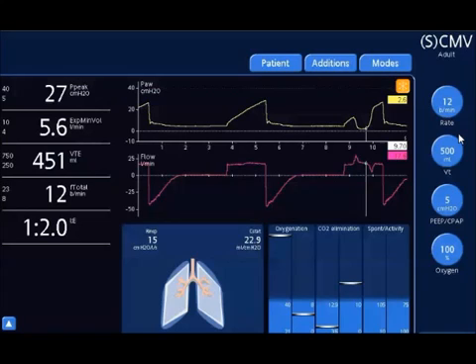And when we are in volume control ventilation, to diagnose asynchrony, my pressure waveform is actually going to be the most diagnostic. So we're going to look at this yellow pressure waveform here on top. And here are my measured values to the left-hand portion of the screen. You notice my measured tidal volume is approximately 500 cc's, and my measured peak pressure is 27 centimeters of water based on this patient's lung mechanics. You notice the resistance is a little high here, and the compliance is pretty low.